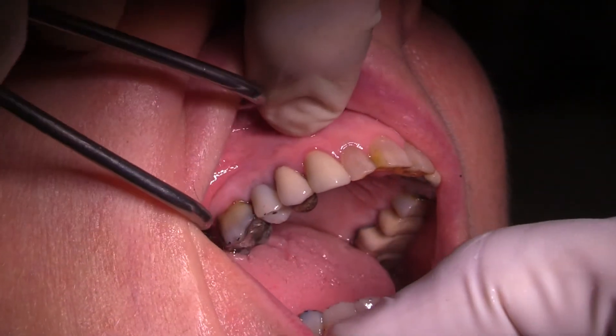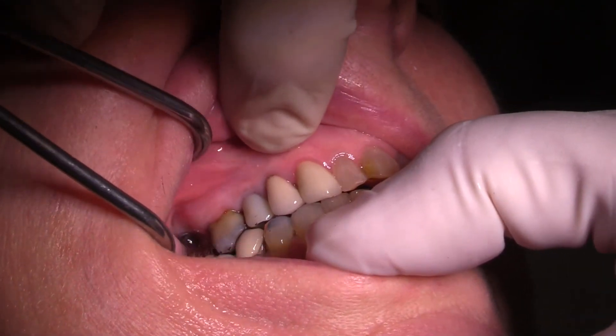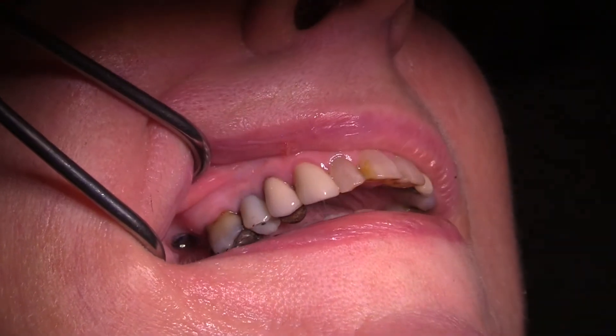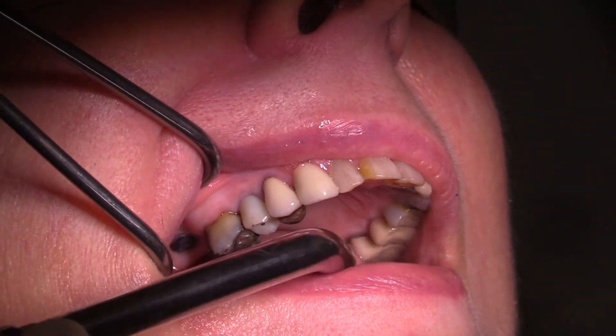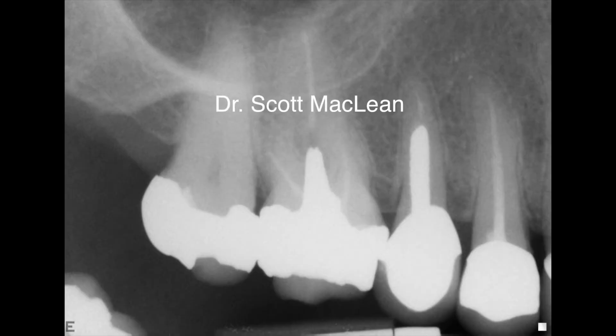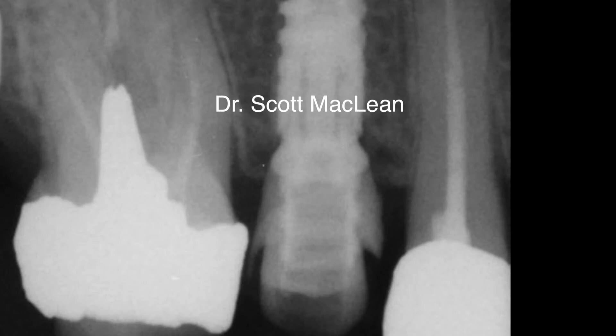We'll maintain group function guidance in the occlusal scheme, keeping it so it's not touching in working, non-working, or protrusion. The guided implant surgery makes it so we can create a very ideal depth and angulation of the implant, so the temporary is restored very simply and so is the final restoration. We get this ideal placement from depth and angulation, making it very safe and predictable for the patient.